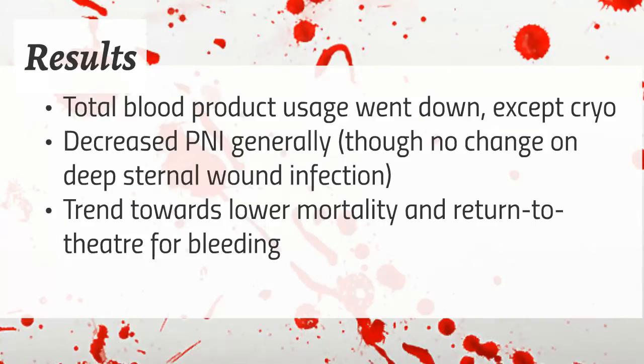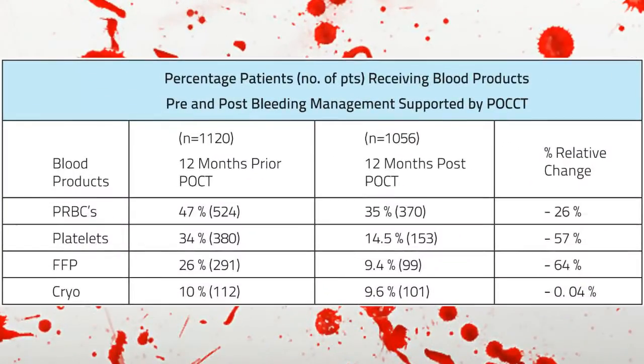What happened? Well, not surprisingly, their blood product use went down pretty dramatically, except for cryo, and they reduced their post-operative nosocomial infections, their post-op infection rates. That's not surprising either. Many other studies have shown an association between red blood cell usage and subsequent infection. There's also a trend towards lower mortality and return to theatre for bleeding. These are just their results.